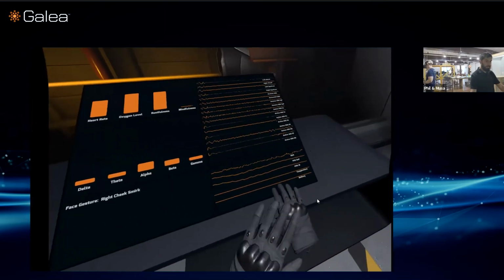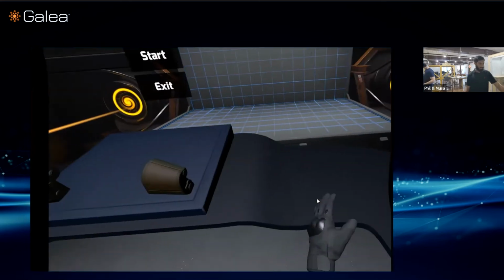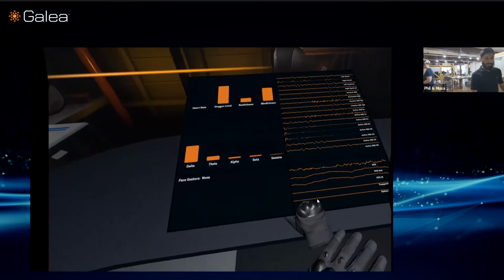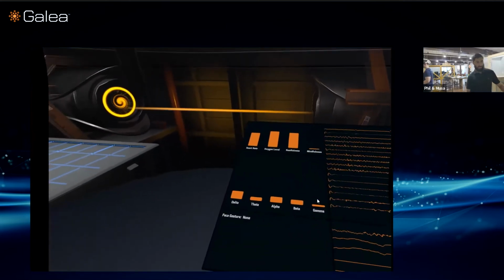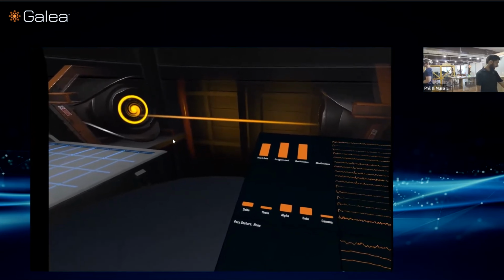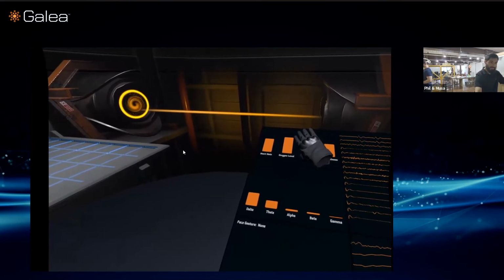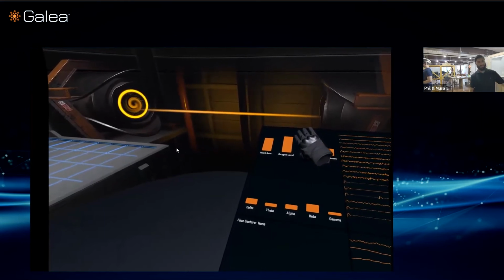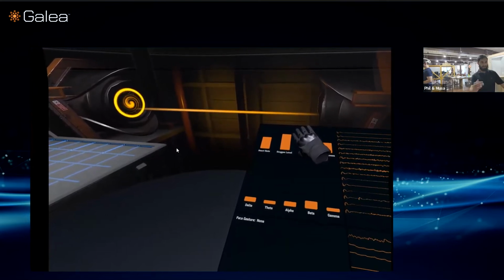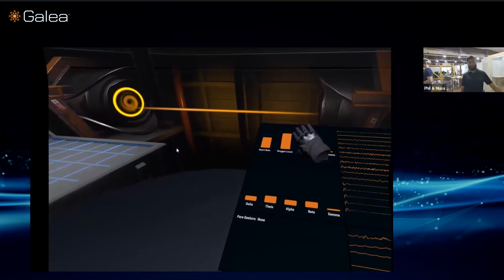Cool. So I think we got this set up again, so let's try the oxygen test again. You ready, Musa? Yeah, so you can start holding your breath now, and then hopefully we can see that reduction in oxygen level. Phil right now is holding a pointer at the tip of the oxygen level. When his oxygen level is saturated, it's at that point, and we should see it decline to about 80% as he continues to hold his breath.